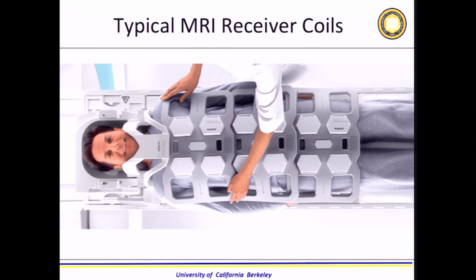They put a bunch of coils on top of you, the receiver coils, that communicate with the coils on the table. These receiver coils don't fit the body very well. They are very heavy and they are offset. Why is this a problem?